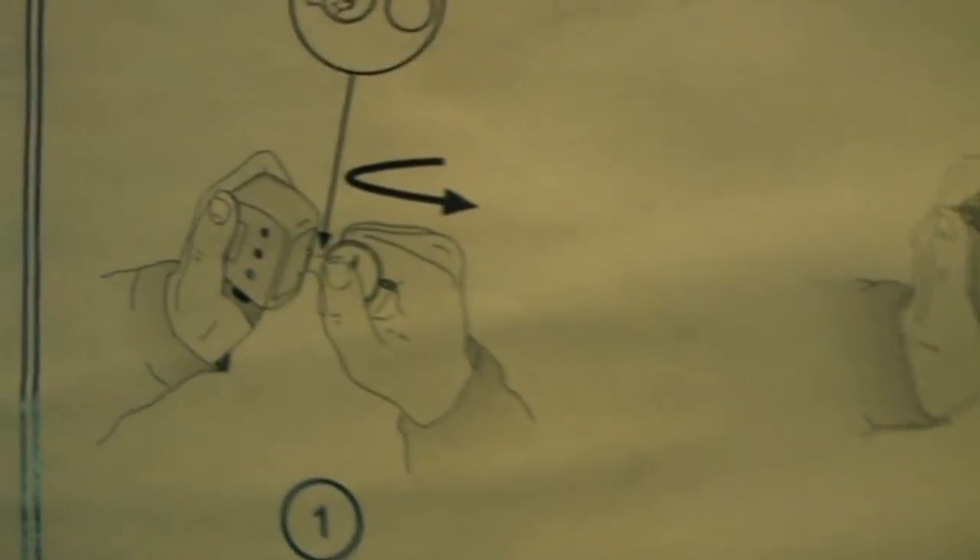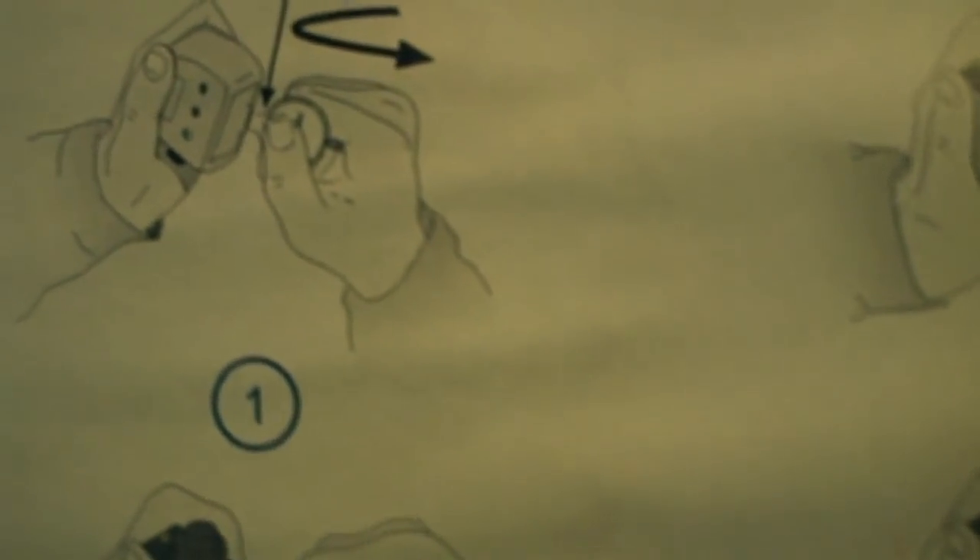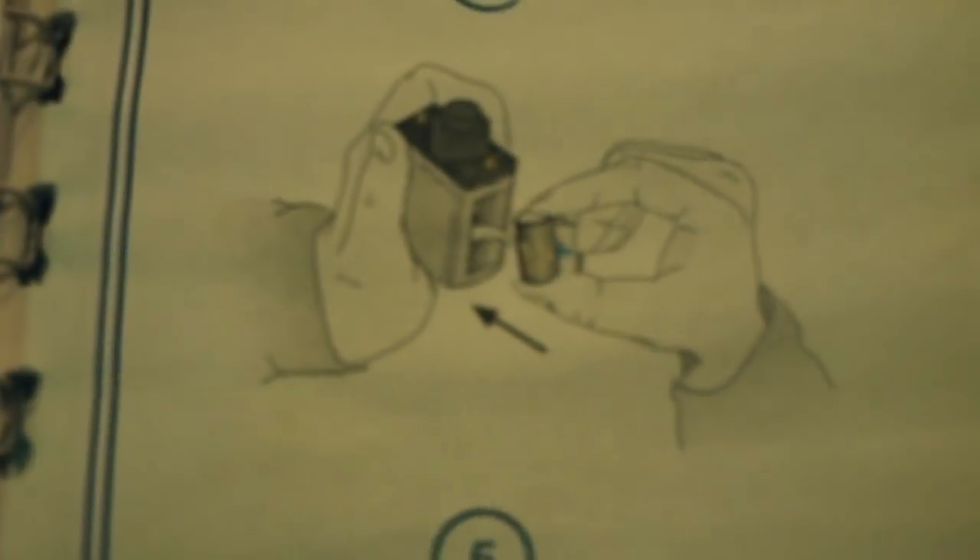For battery replacement: use the cover opener to open the cover, then take out the battery and insert a new one. It's not that hard once you get used to it.